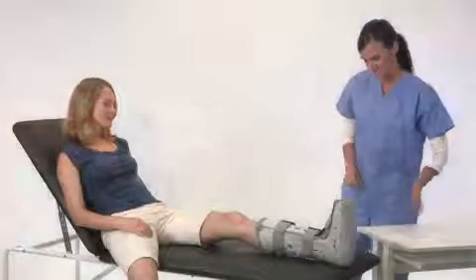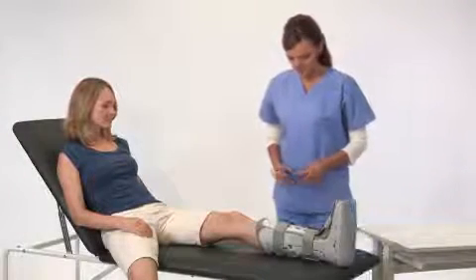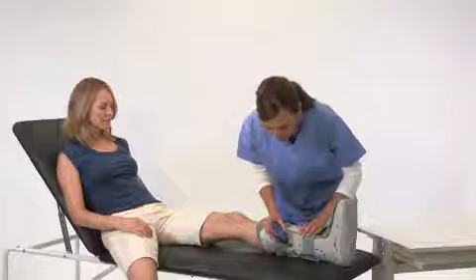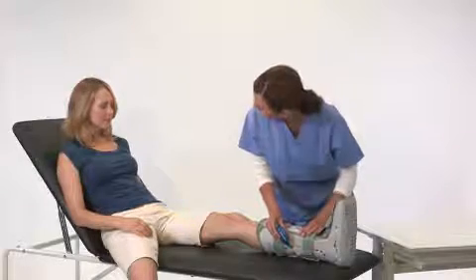Since the FP walking brace air cells are initially deflated, you'll need to inflate them. Start with the valve on the inside of the leg and then follow with the valve on the outside of the leg.